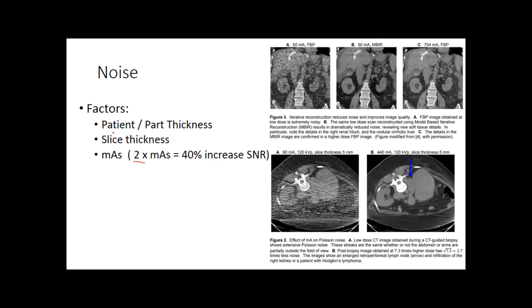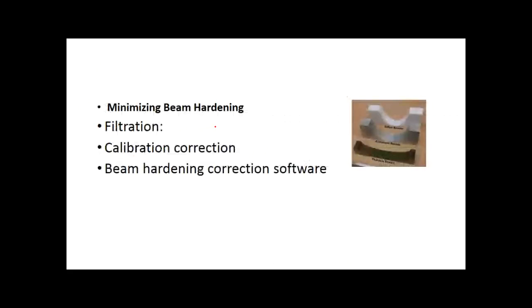Other factors, sometimes we cannot control. For example, the patient or part thickness. The more it is, the higher the noise. The slice thickness, if we increase the slice thickness, noise will be reduced. But sometimes we are limited, according to the clinical indication, in slice thickness.